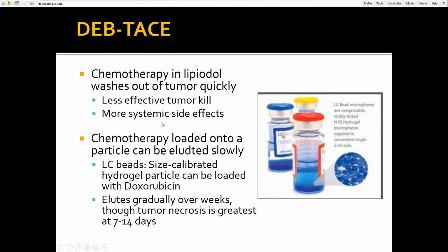utilize here. So again, just a picture where you have the blue beads, and then you mix them with some red agent such as doxorubicin, and it changes the color once everything's bound to red, and then you can go ahead and treat those particular tumors. So you can mix the beads that have a charge on them with the doxorubicin, and it's a plus-negative kind of binding, and once they're all bound, then you can go ahead and treat the patient. I think it's a cool thing to use to treat these patients now.